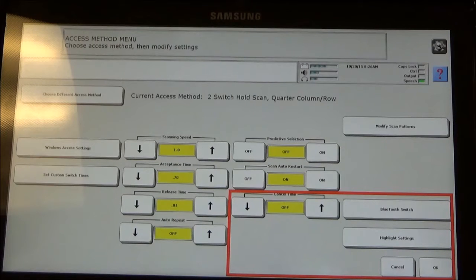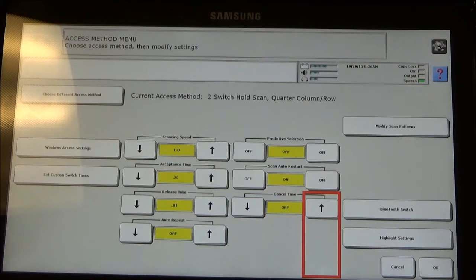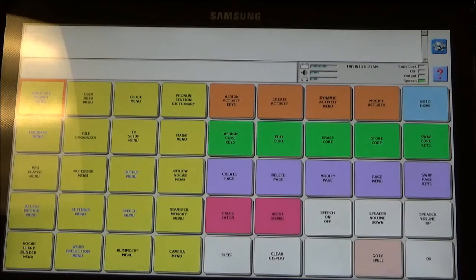Now I'm going to create columns with my left hand, the blue. I'm going to go over holding down with my right hand. I'm going to release, hit it again. Oh, sorry, that was my mistake. So we go with the right hand, we go all the way to where the column is, where OK is. Then we select with our left hand the blue. Now, with the right hand, we scroll down. And with the left, we select it. We actually select the key. And we're back to where we started.